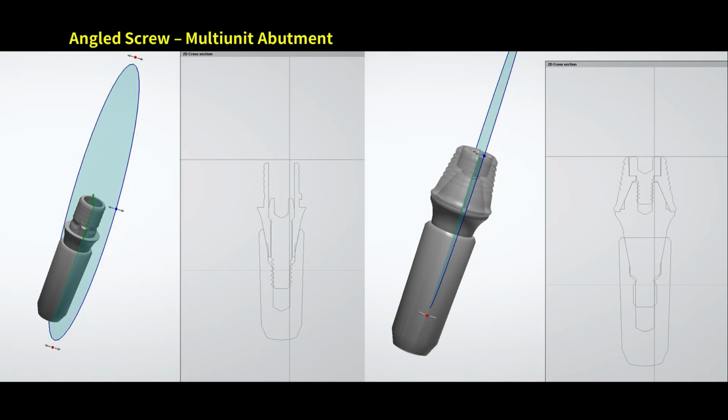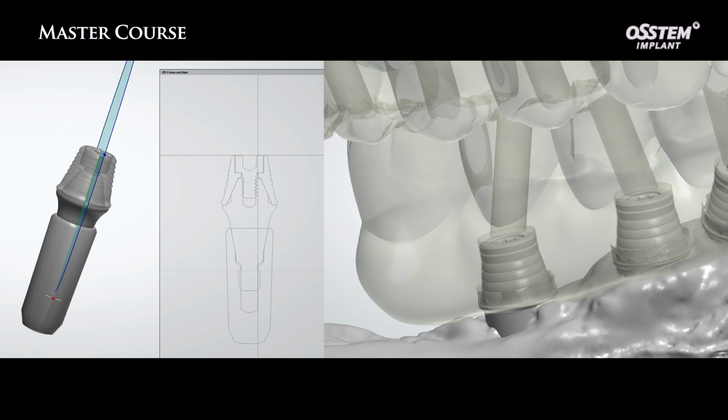Next, multi-unit abutment. On the left side, if you look at the link abutment, the screw is on the lower side compared to the cylinder, but on the multi-unit abutment the screw is on top of the cylinder. So if you give an angle, the metal part is not hinged. So if you have to twist the direction of the screw, sometimes it's better to use multi-units.